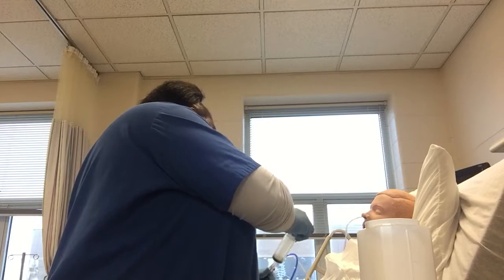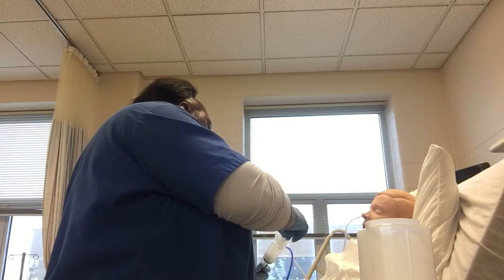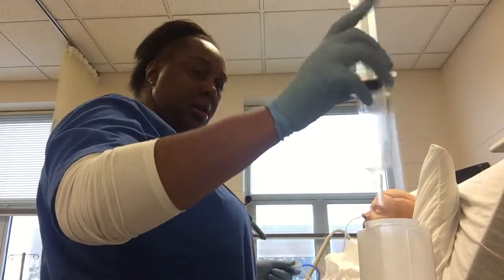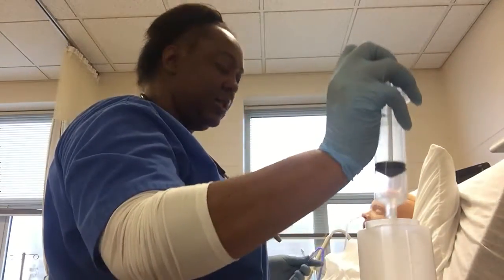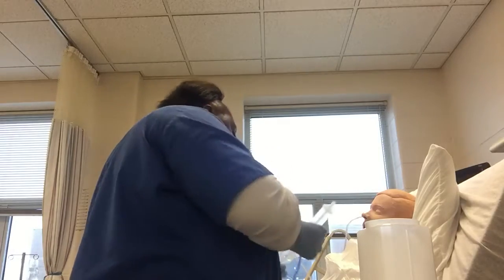We'll insert this, pull out any residual, and then test it. Yep, place that in there. Here again, pull out, test it.